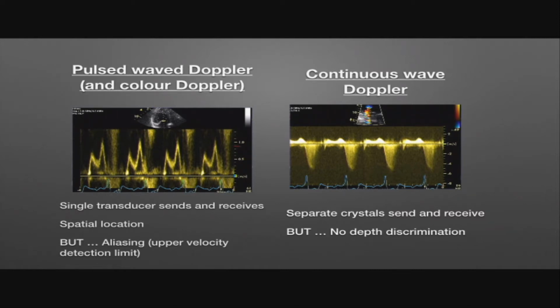So a good pulsed wave envelope is something that has a very sharp, delineated edge. I think this is a pretty good pulse wave Doppler signal that we've got there. It's got a nice sharp edge, and we have a nice black inside to the envelope, which means that it's not picking up any movement in those velocities down there. So a nice sharp edge, okay?